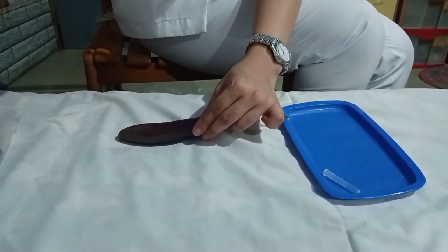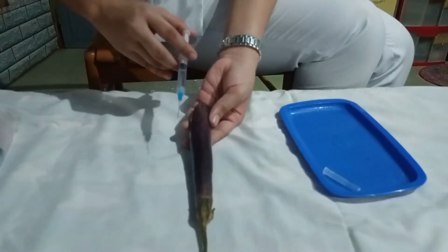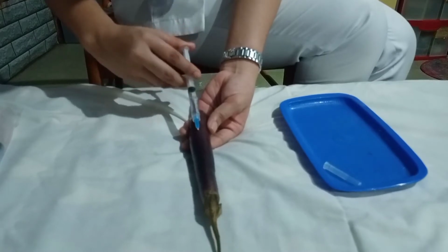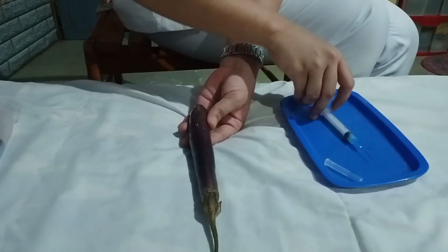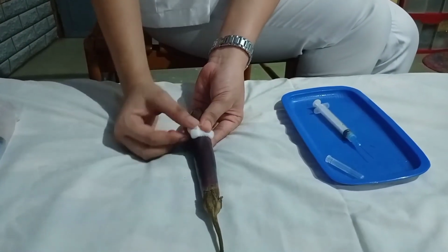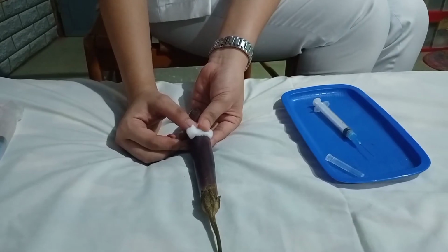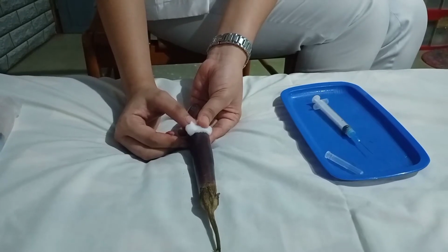Inject the needle quickly at an angle of 45 degrees. Make sure that the angle is flat, so you can inject the medication easily. Release the medication and put a cotton. The rationale is that pain is minimized by inserting the needle without hesitation, and subcutaneous tissue is abundant in well-nourished, hydrated persons and scarce in emaciated, dehydrated ones.